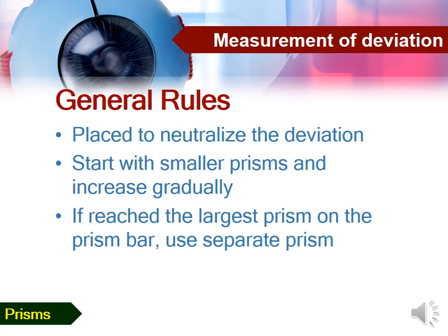In general, prisms are placed to neutralize the deviation. We start with smaller prisms and gradually increase the prism power. If we reach the largest prism power on the prism bar, you can use a separate prism of a larger power.